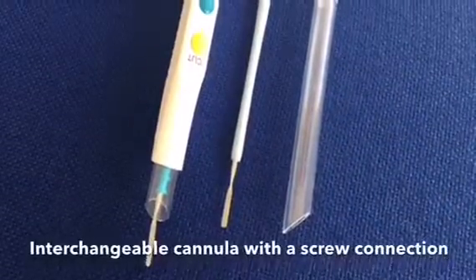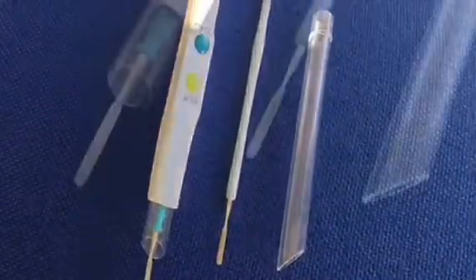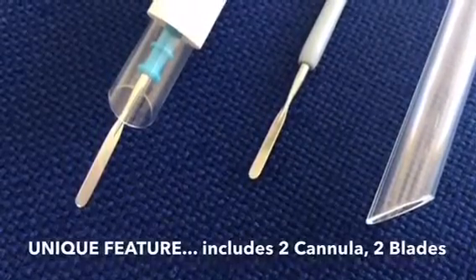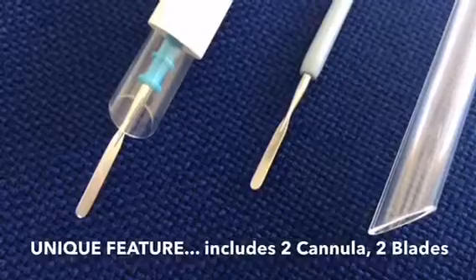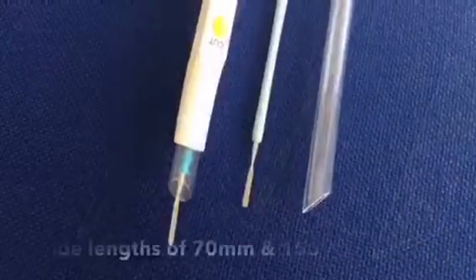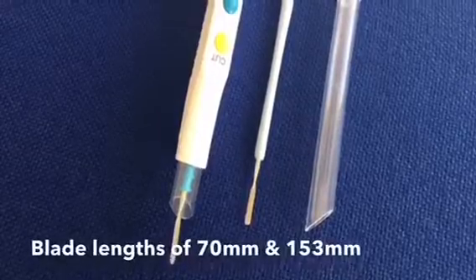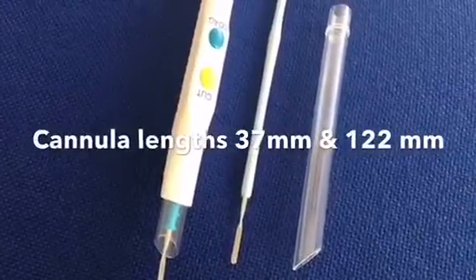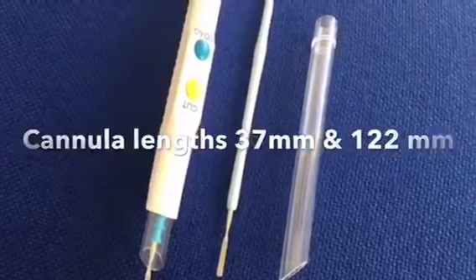Interchangeable cannula with a screw connection. A unique feature of the pencil is that it includes two cannulas and two blade electrodes of different lengths. Disposable blade lengths of 70mm and 153mm; cannula with screw connections, lengths 37mm and 122mm.